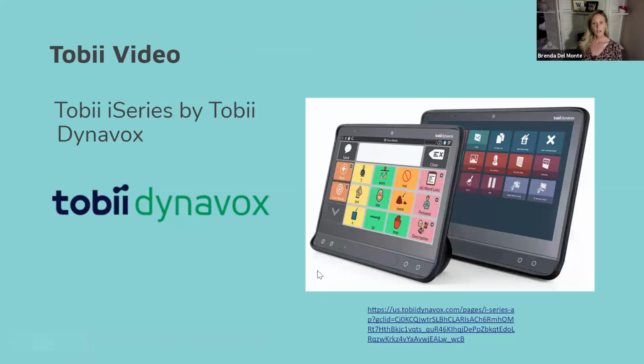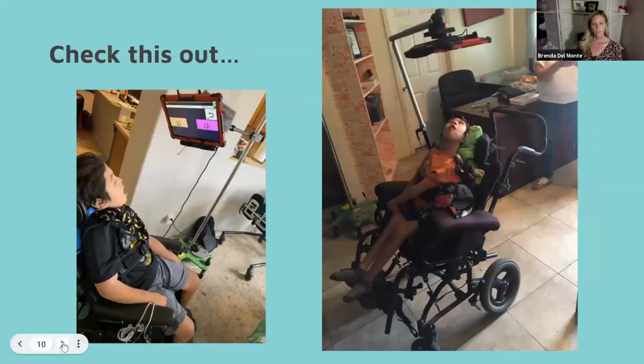Sorry. But I wanted to show you guys two mounting situations because this is an example. Neither of these kiddos are actually in the position that the OT or PT or anybody in life would want the one on the right to rest in. But that is the way his spine goes. So we have mounted it the way he can be at rest. And then they get him out of his chair and stretch him, and they do all kinds of things to work on that curvature of the spine.